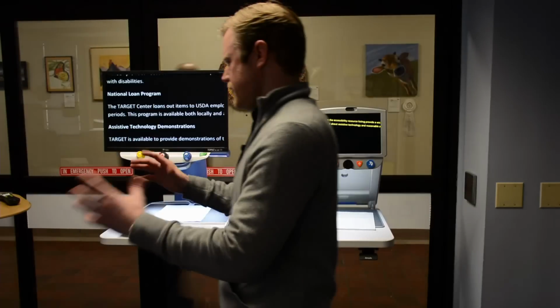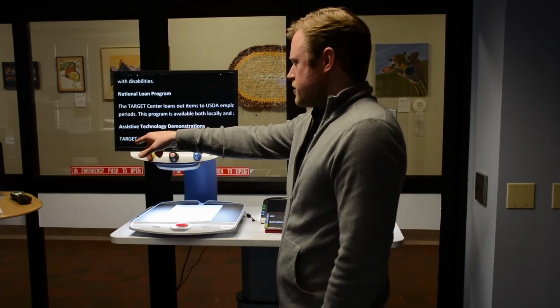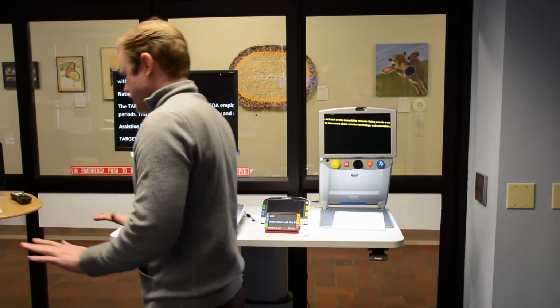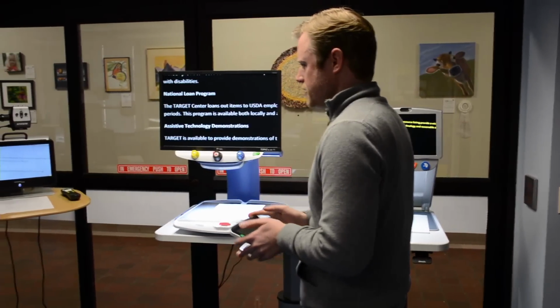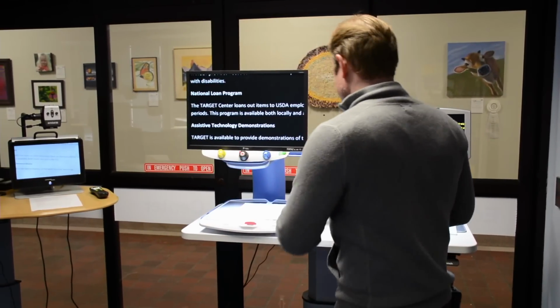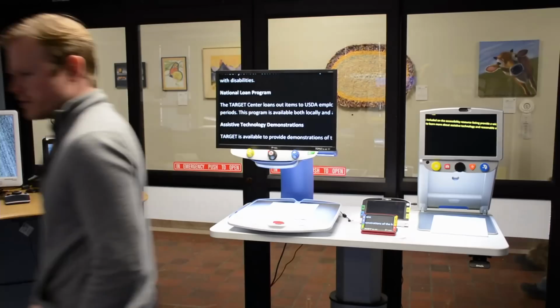They even have, we don't have one here, but there's one that's 13 inches that actually lays down, kind of similar to this one, but it can be in your lap. It's kind of like having a laptop screen, and you can move and magnify. That one's, I think, really called the Optilec HD 13-inch.